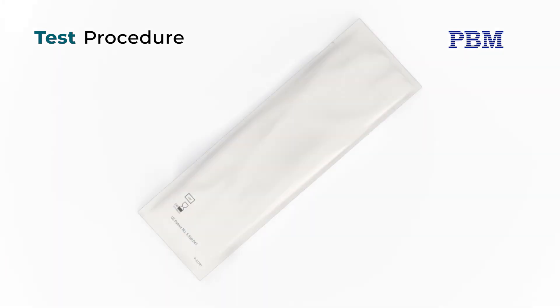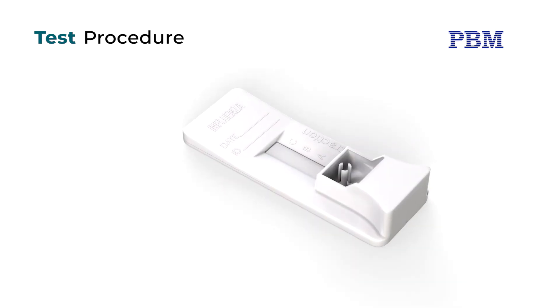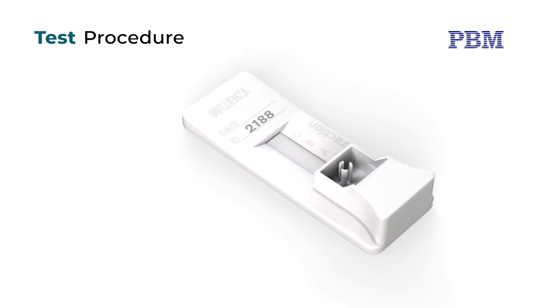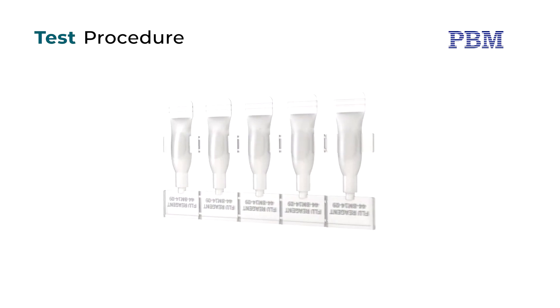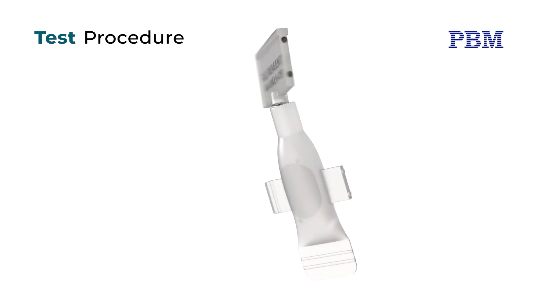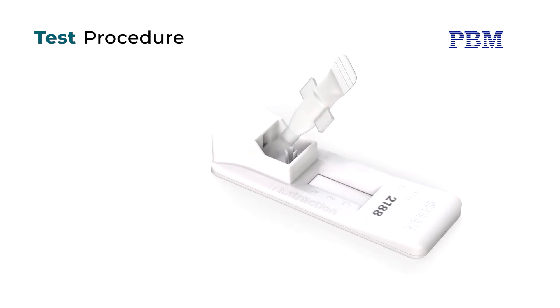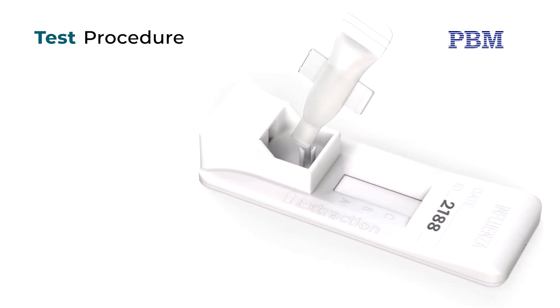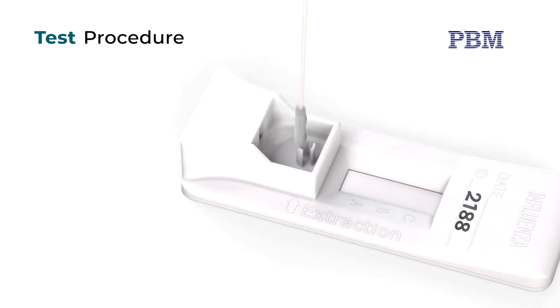Once the patient swab has been collected, open the foil pouch. Place the cassette on a level surface and label the cassette with the patient identification. Remove one extraction reagent capsule from the strip and tear off the tab to open. Squeeze the reagent capsule to dispense all of the reagent into the extraction well of the test cassette. Insert the patient specimen swab into the prong swab stand in the extraction well.